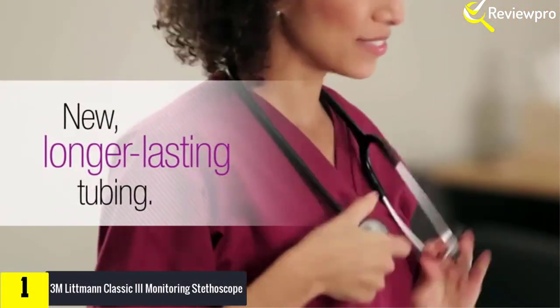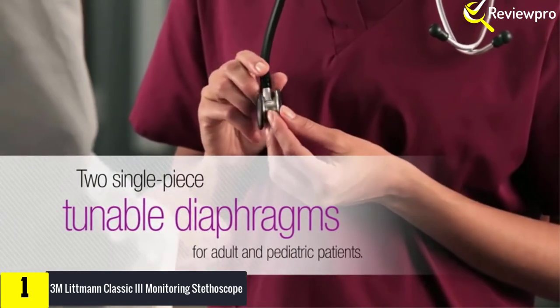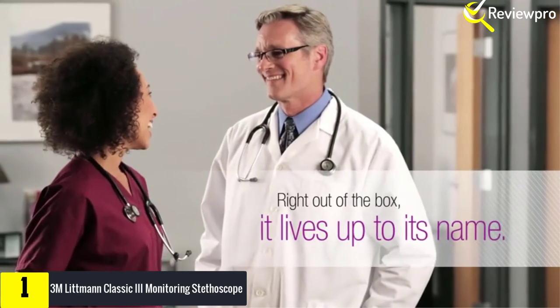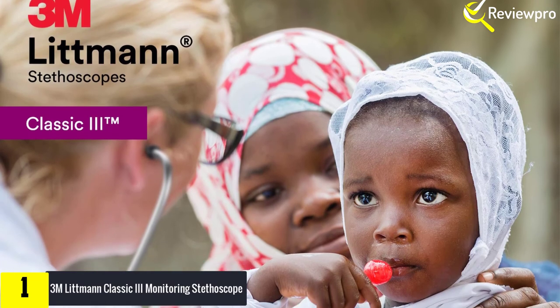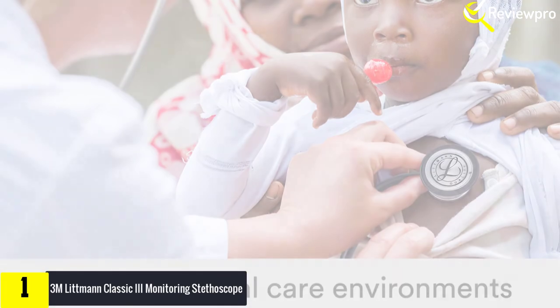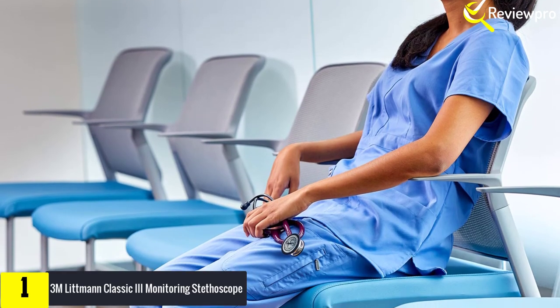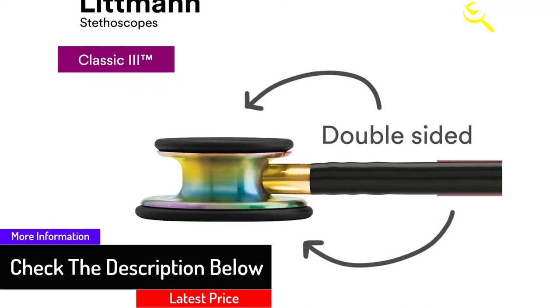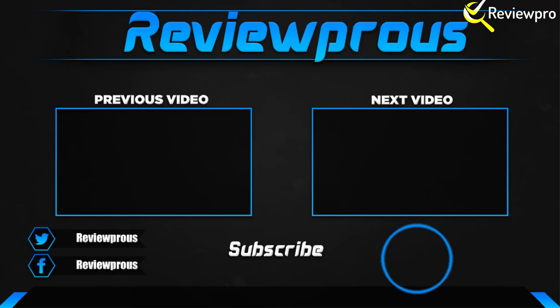Finally, at number one, we have the 3M Littmann Classic 3 monitoring stethoscope. What you will like about this stethoscope is the outstanding acoustic sensitivity that makes it a high-performance tool for general physical assessments. There are two tunable diaphragms on both the pediatric and adult side of the chest piece, making it dependable for medical professionals and students who need to listen to and identify body sounds, lung and heart functions, as well as patient diagnosis and monitoring. The diaphragm has a single-piece design which makes it easy to clean and attach since there are no crevices. However, switching to the pediatric diaphragm when using the open bell can be difficult, so some users use the bell on one side and the adult diaphragm on the other.